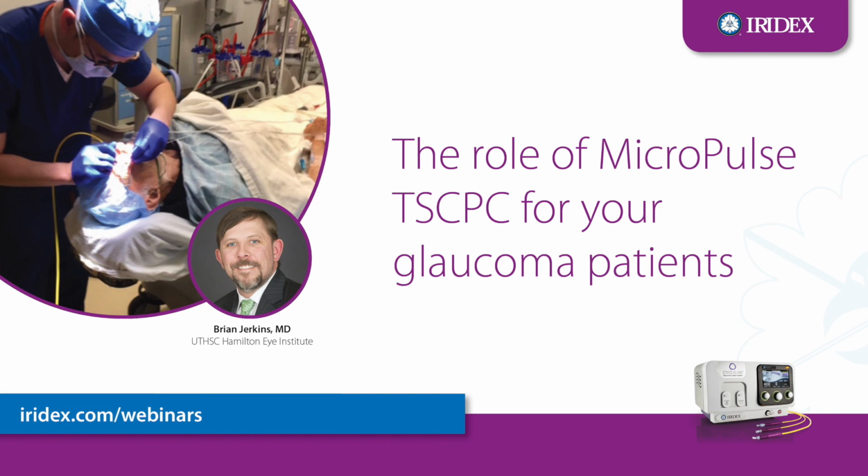And in my instance, or a patient who maybe I got a little bit too closer to the cornea during the procedure. But the dry eye is something in some patients that does take a little bit of time to clear. And again, it's patients who were really dry in many instances going into it. So it's hard to tell whether it's procedure or just the patient themselves.